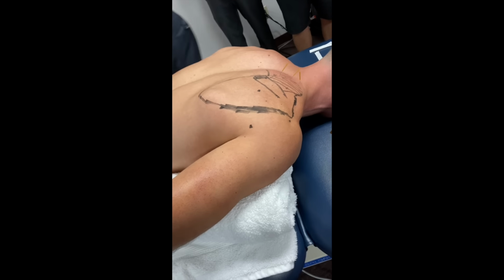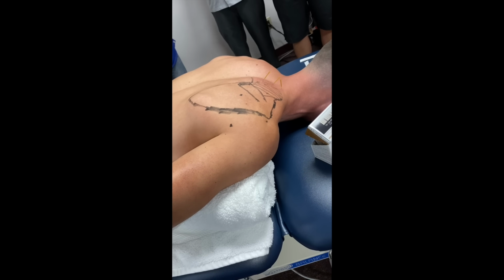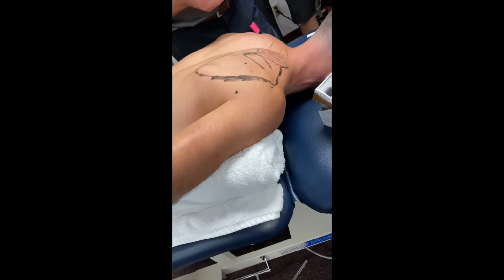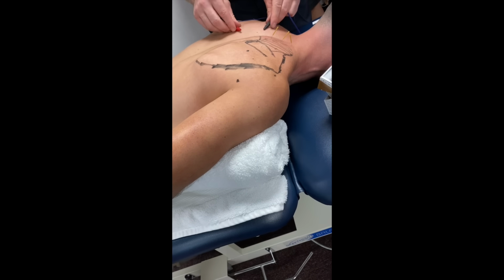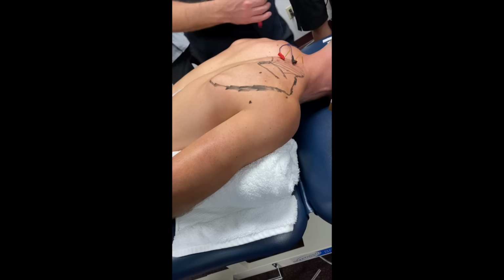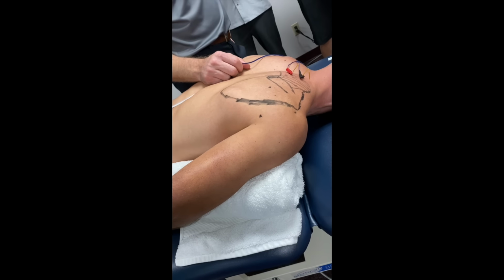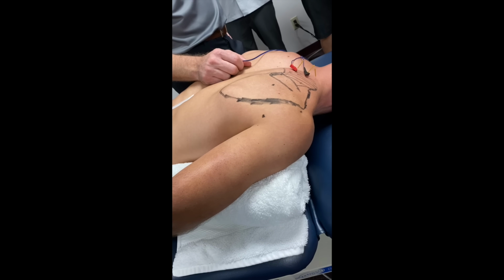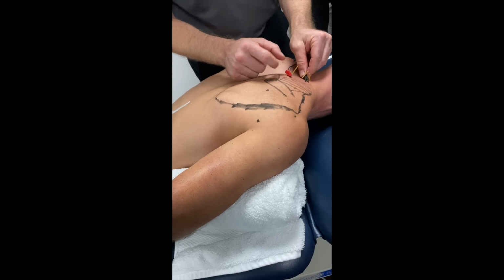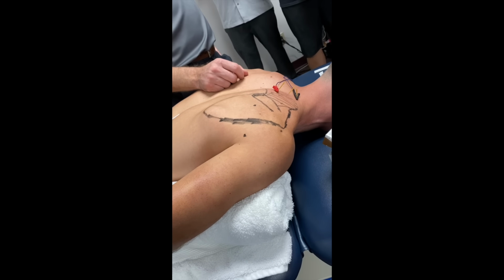And then, you know, you could do a bunch of different things here. That's okay, I'm just gonna show them that. I could come, and if it was just an attachment problem, oftentimes I'll do this. And do the two that are at the attachment. That should at least get enough electricity so that I'm able to hit the places that I want. If I feel like it's maybe an attachment and a muscle problem, well then maybe I could do this too. And I could run it from the attachment to the muscle belly. That's okay too.